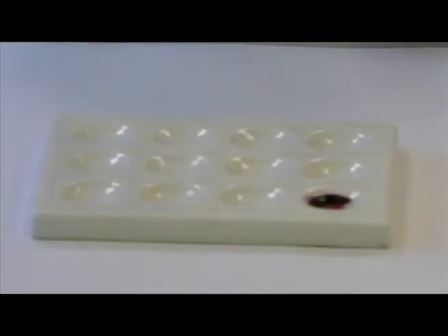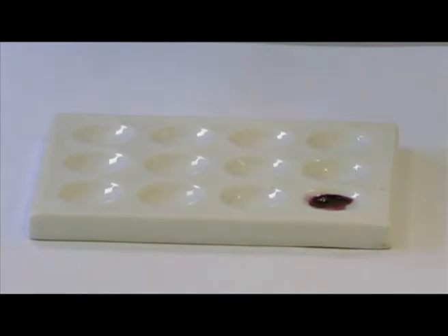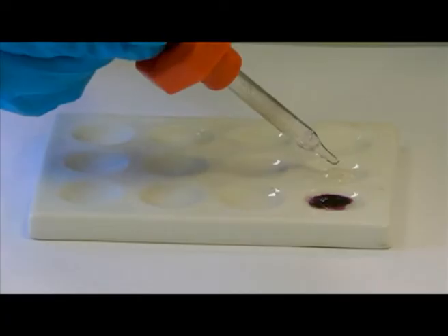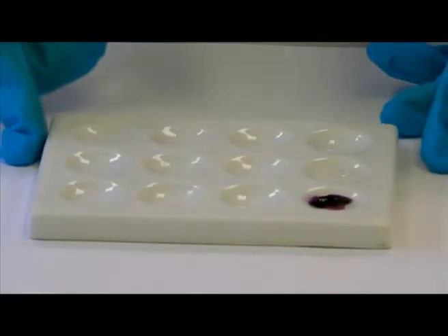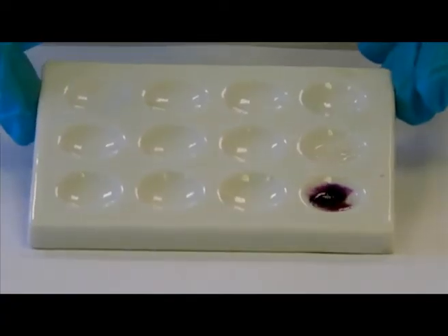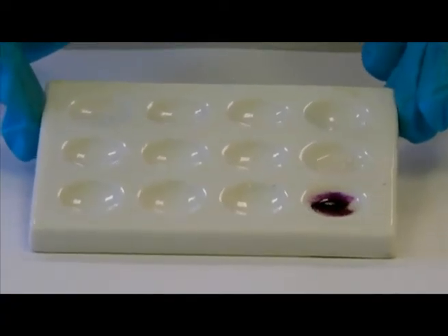The next step would be to add our marquis reagent into the well of the spot plate to produce our negative control. As you can see, it's negative because we've got a colorless solution. It's not changed color at all.